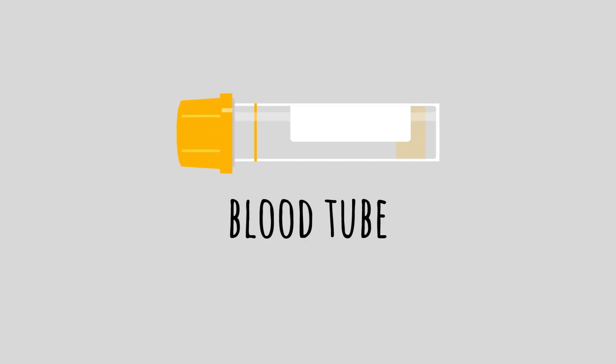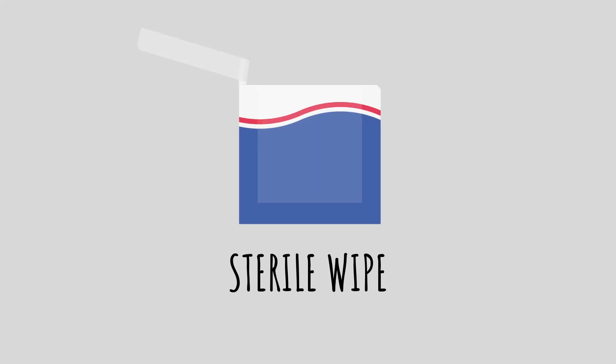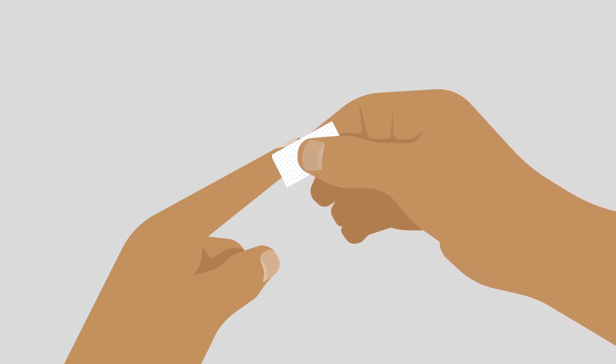Take the blood tube, then unscrew the top and stand it upright in the tube stand. Next, use the sterile wipe to clean the side of your index finger on your non-writing hand.